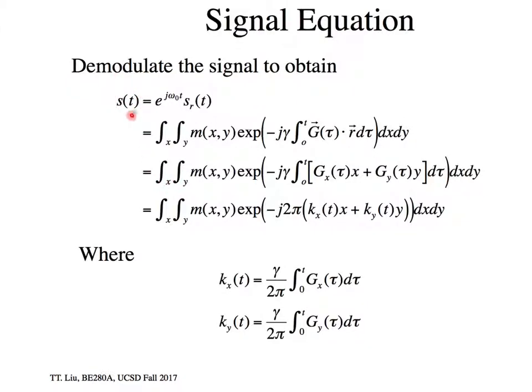So that provides me with a complex time domain signal, S of t.